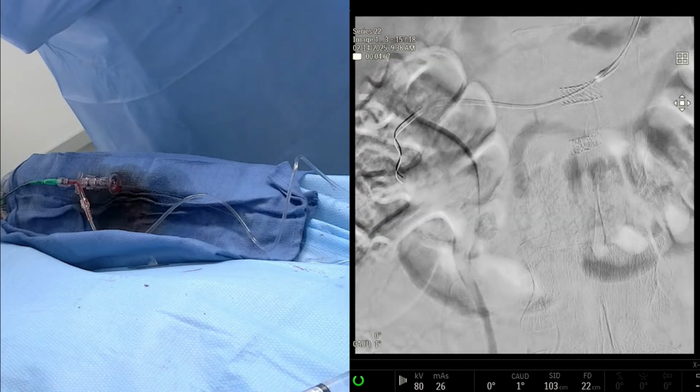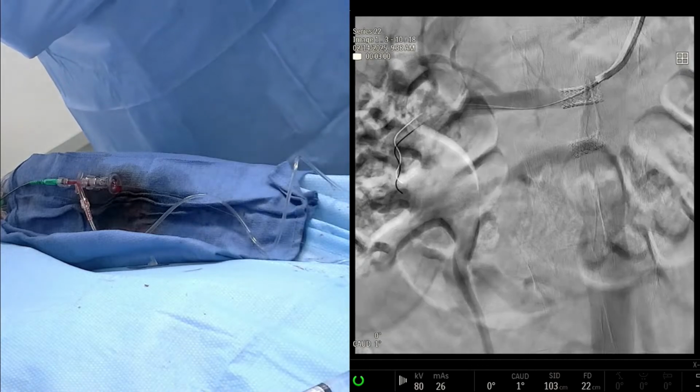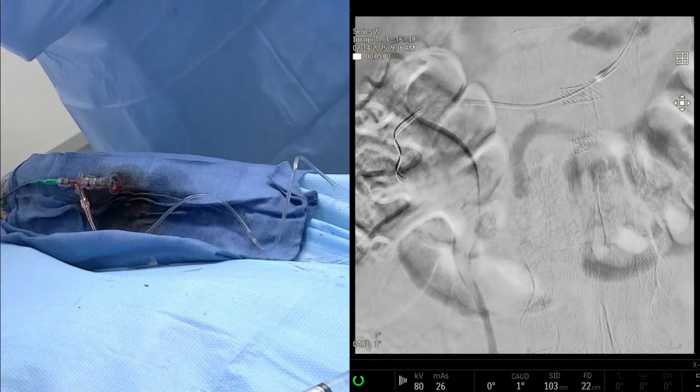As a routine, do you think we should re-IVUS this or redo an FFR, or do you think we should go to the other side and try to wrap things up?